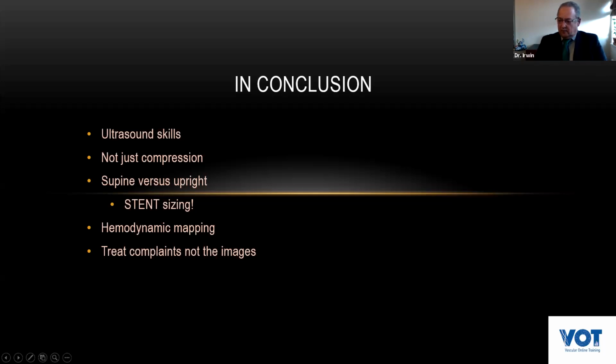Hemodynamic mapping, find out where the flow is going. Is this really related to the complaints that the patients are describing? And I say, in the complaints, treat the complaints and not the images. No matter how nice or how convincing the images are, you must ask the patient again and again and again and assess their complaints accurately.